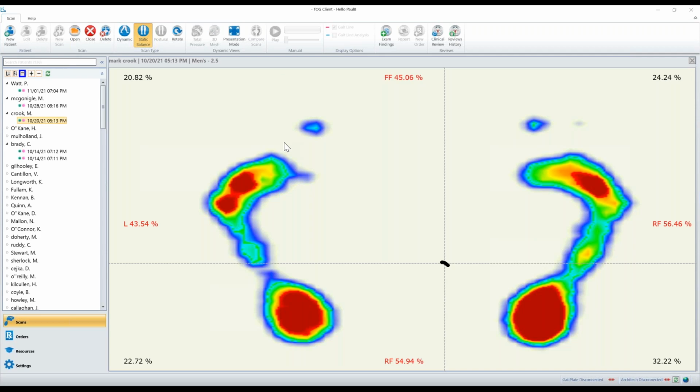This patient would or could be booked in for an appointment to assess, to find out which one of the aforementioned needs treatment. Then you would look at it and decide whether or not you're going to work on strengthening for the peroneus longus, or do a program of stretching for tibialis anterior. Do you want to do deep tissue massage on the calf muscle?